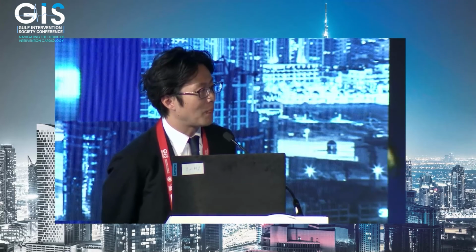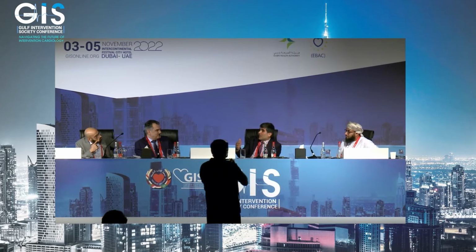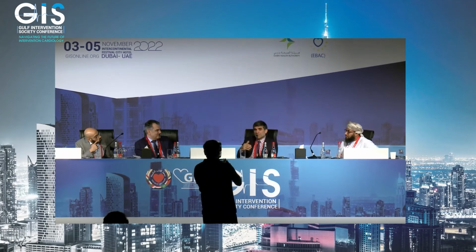My understanding is that globally, in about 5 to 10% of bifurcation stenting, especially using DK crush, you are not able to cross. In the expert hands who created this, it was 7% they could not cross. In some registries, up to 16 to 17% could not cross. I suppose sometimes we have to be a little bit pragmatic rather than dogmatic. It's perfect to be able to do the OCT, but ultimately it is the clinical outcome.